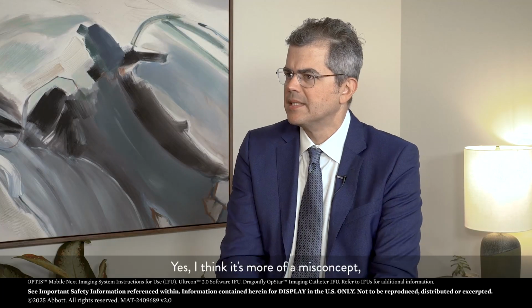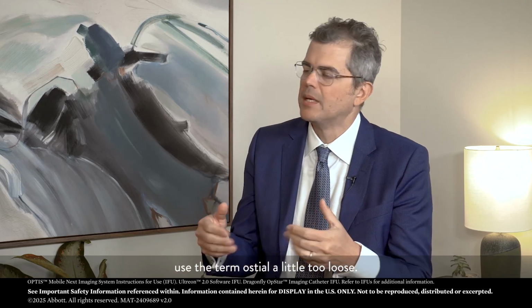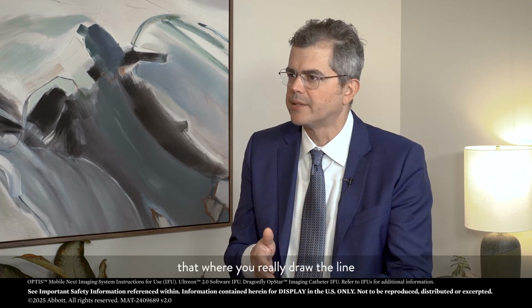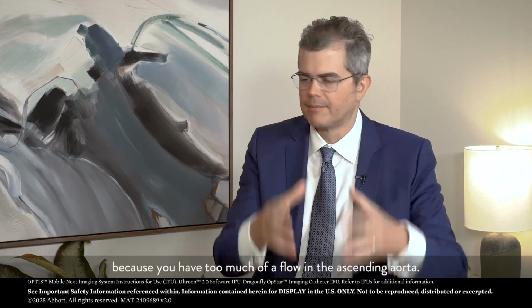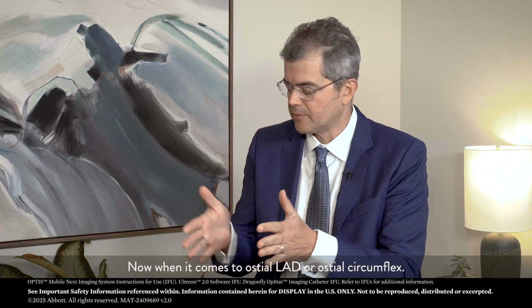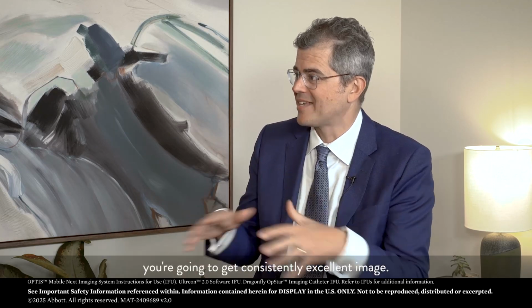Yes, I think it's more of a misconception, and I think it comes from the fact that sometimes we use the term ostial a little too loosely. We discussed already, on image acquisition, that where you really draw the line, where you're not going to get a consistent image, is proper ostial left main, because you have too much flow in the ascending aorta. Now, when it comes to ostial LAD, ostial circ, or distal left main proper, you're going to get a consistently excellent image.